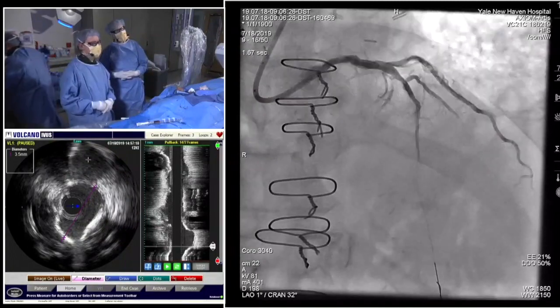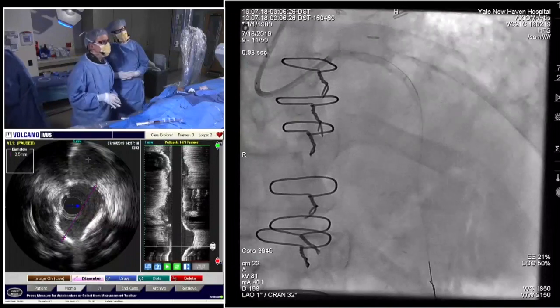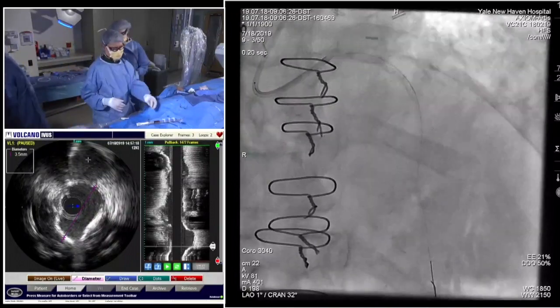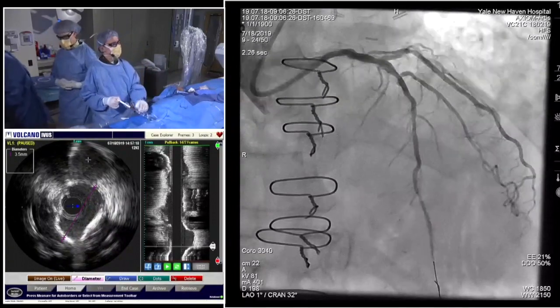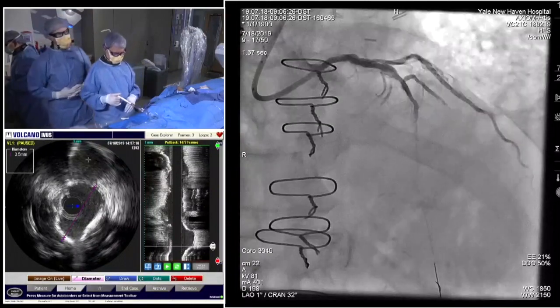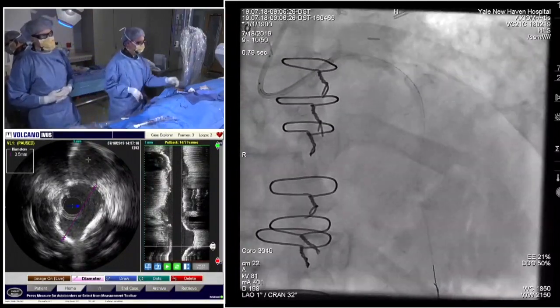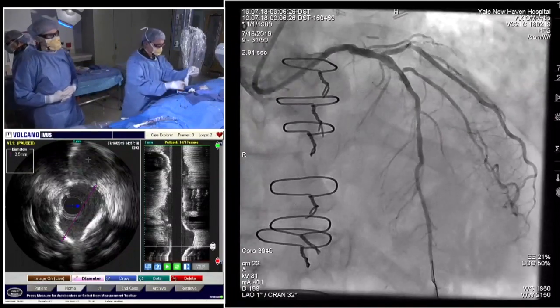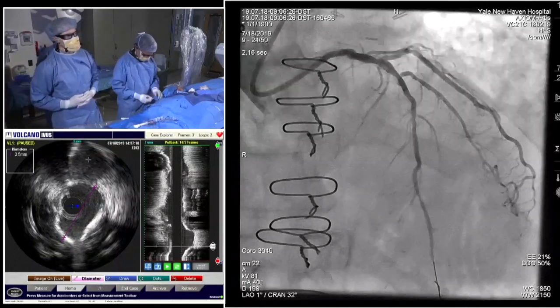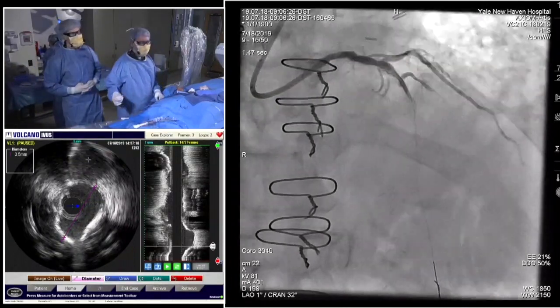This may even be a case where you need 3 separate stents just because that distal vessel is so small, and I don't know if you're going to want a 2.75 in that proximal LAD. Yeah, I think, Jason, you're looking at a 2.5 for the distal stent, and as was said before, the key is to make sure the stent ends in an appropriate area, no distal edge dissection, not a significant burden of disease, and we can post-dilate it and make it appropriate size. So we know how big we can make it now.